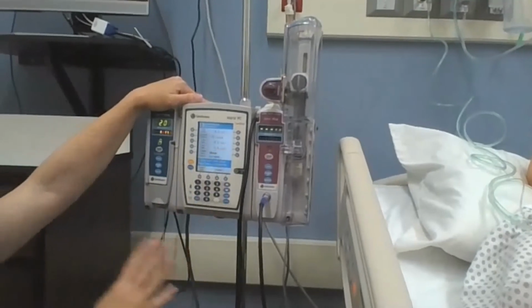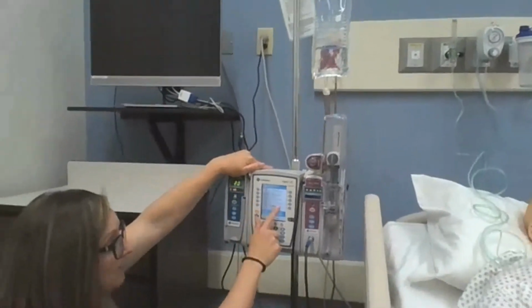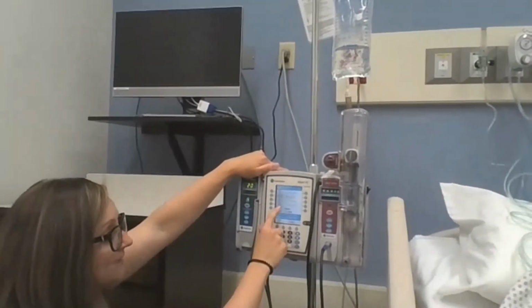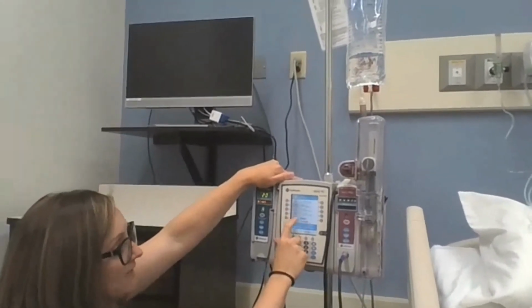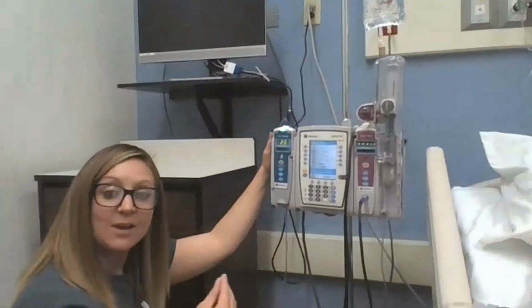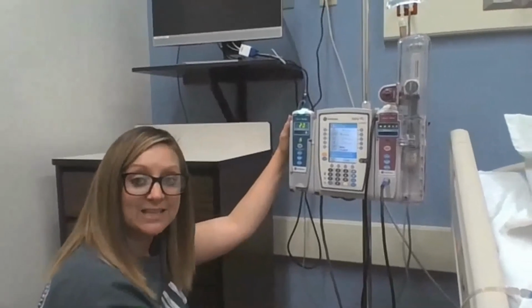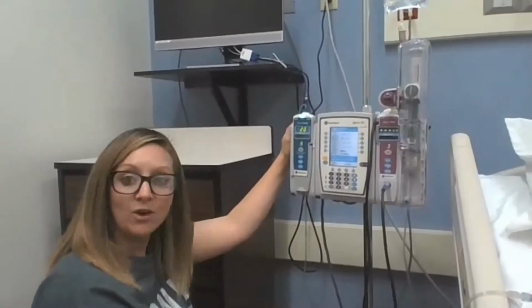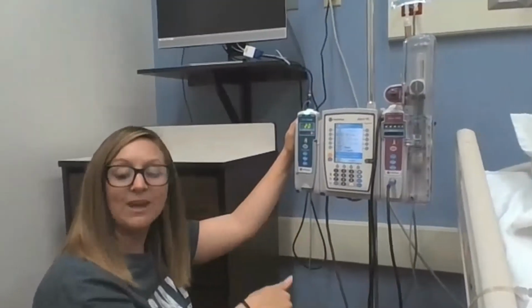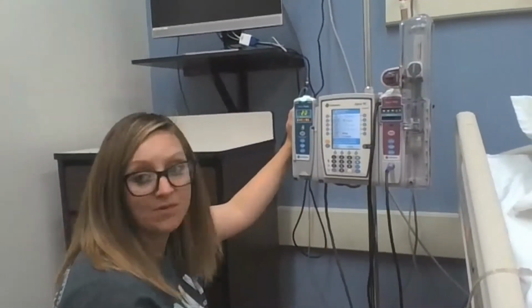At Midland Memorial, this will actually be a 4-hour limit for most of our orders. It kind of depends on how the physician orders it, but most of the time it'll be a 4-hour maximum there. And so then 4-hour max, this out here says 1-hour max, and it'll say the max limit is 1.4 milligrams every hour. So if in an hour I hit 1.4 milligrams based off of what's continuously infusing on my basal rate and what the patient gets from hitting the button, it's going to stop infusing everything until that hour is up, and then the nurse can reset it and it'll kick back in so it can start administering medicine again. So these are just additional safety features that are built in to prevent overdose.